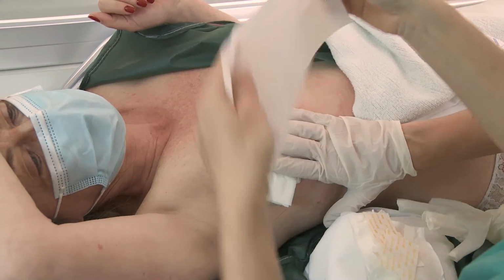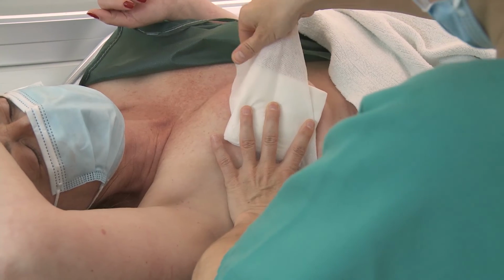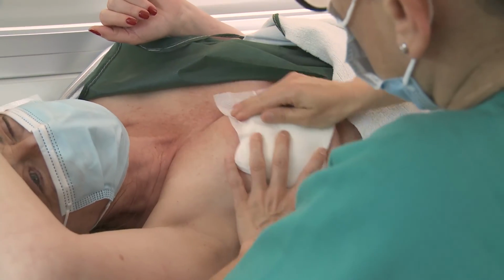The entry point area is covered with an adhesive gauze and a compression bandage, which is removed after 24 hours.